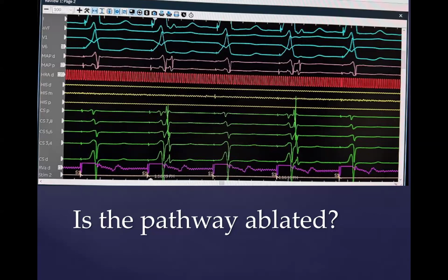So that's the reason we don't typically burn inside the coronary sinus, and why, if there's any way to get a pathway that does not involve going in the CS, that would be the preference. Sometimes it's the only way. Sometimes pathways are right inside the mouth of the coronary sinus, in which case it is safer and easier to do it that way. But even then, one needs to be very careful about too much energy and having a perforation, which can be a very serious problem.